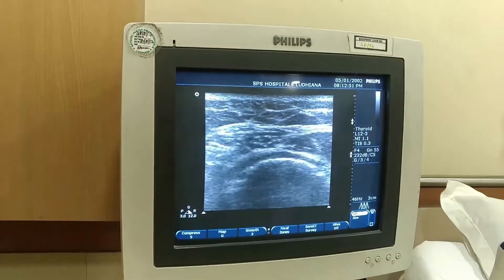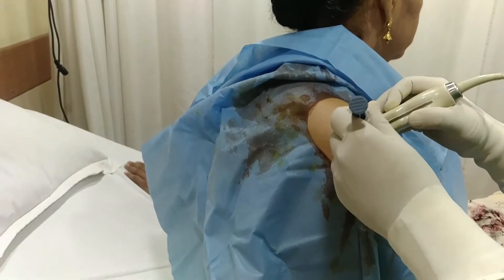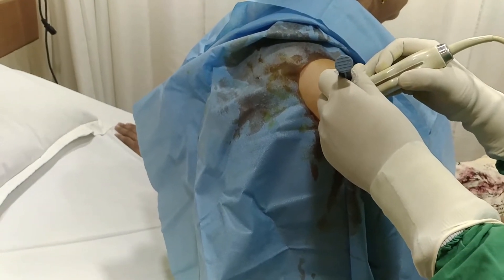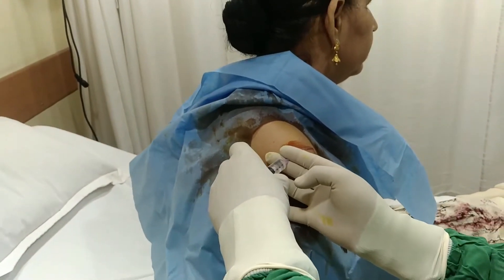So how we'll go about it is, now on the skin, we'll put in a little bit of local anesthesia. Check this — like a key. So, let's give some local anesthesia.